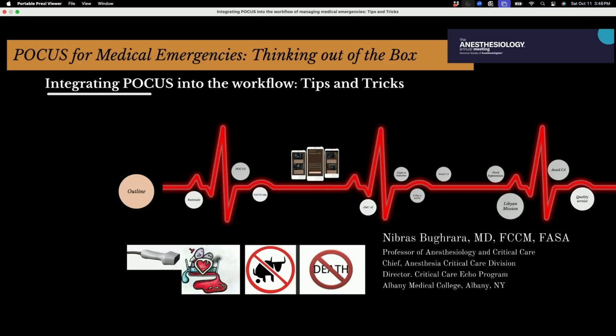Just learning these views and learning the pathology, knobology, pathophysiology is too much. So I think if we lower the entry point in a safe way, where we focus on one view and show the pathologies that are really life-threatening, then this way you learn your machine, you learn your knobology, you learn how to evaluate the image quality of one single view. I always time my residents, they have only 3 minutes to obtain the exam. If they don't get it, then we get the fellow or someone else who did critical care echocardiography to get more views. So it's really lowering the entry point in a safer way, having a structured approach where we save all the images so we can continuously give feedback.